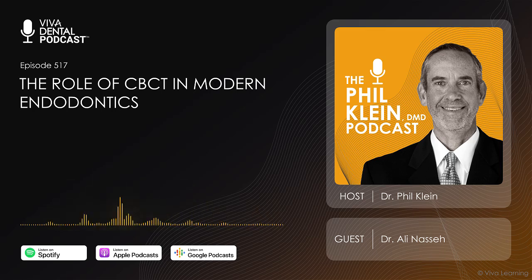There have been studies that have been done where a group of endodontists were given all of the available information to make a decision about a treatment plan. And they were supposed to make a treatment plan for a given tooth. And then the same people were given a CBCT image, a 3D image, and then they were asked to look and evaluate that, and they wanted to see if there was a change in the treatment plan based on the 3D imaging. And they found that in almost 50% of these cases, the endodontist changed their treatment plan as a result of the additional information.